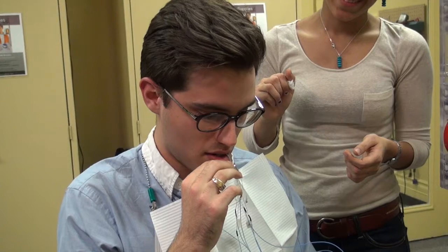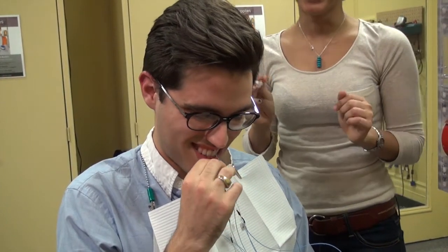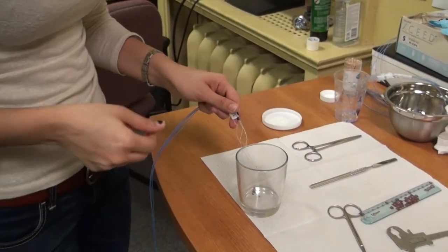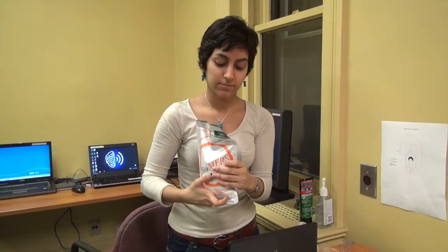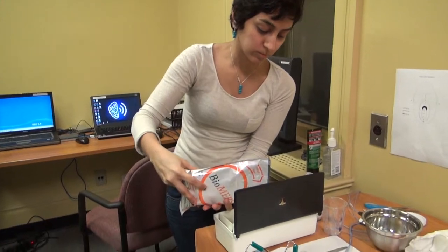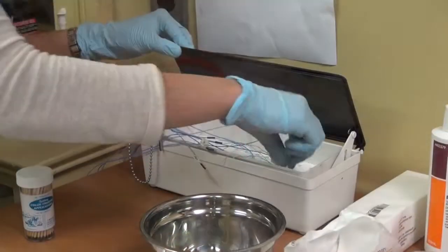After the experiment is completed, the coils are removed from the mouth, placed in a solvent to remove the latex, and finally soaked in a disinfecting solution before use with the next participant.